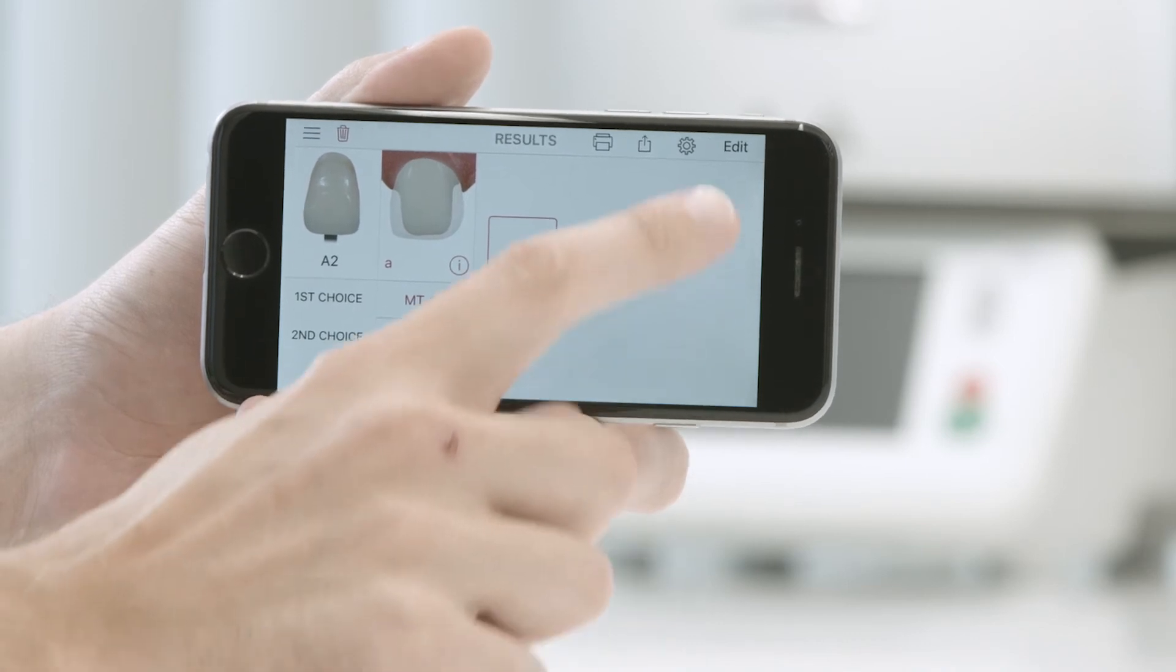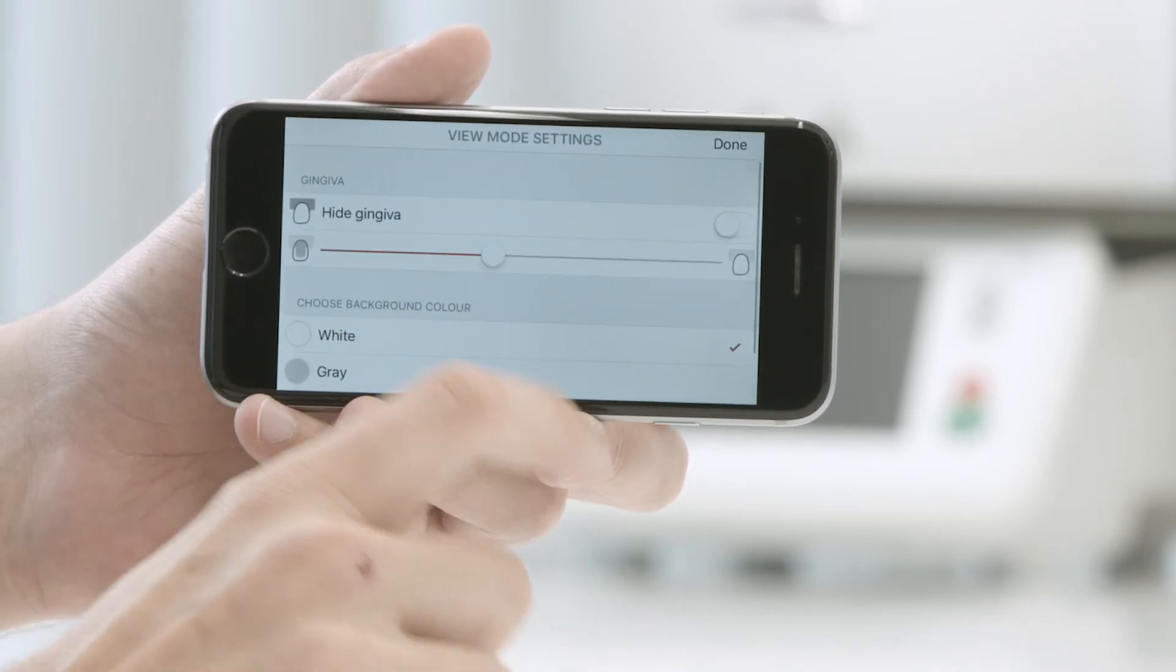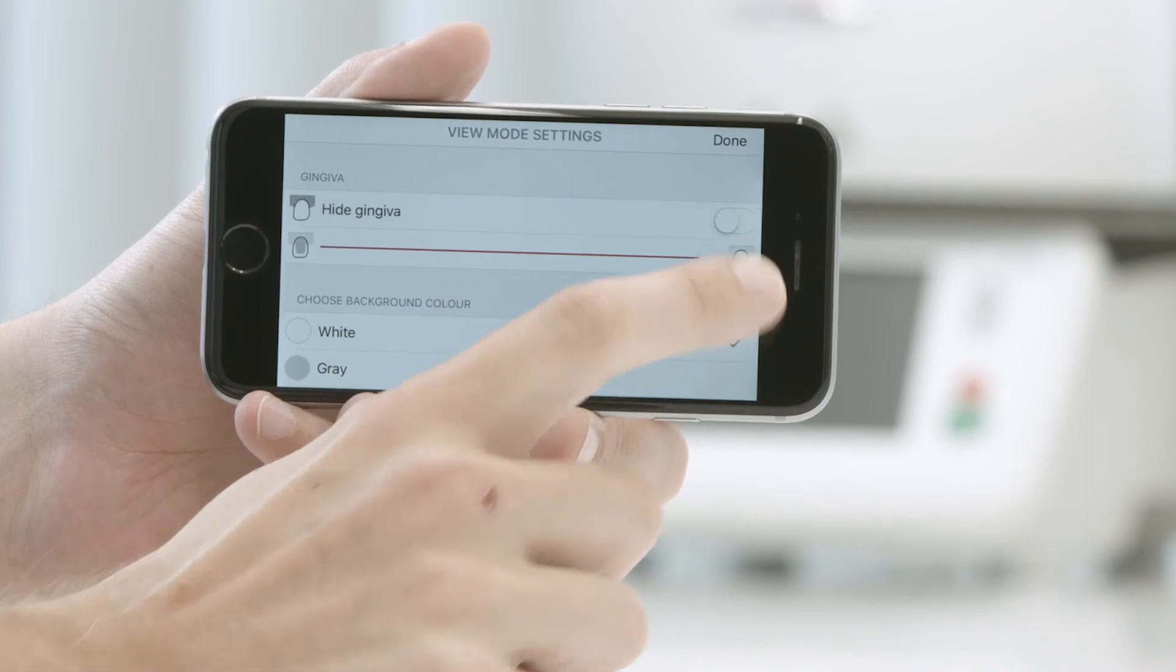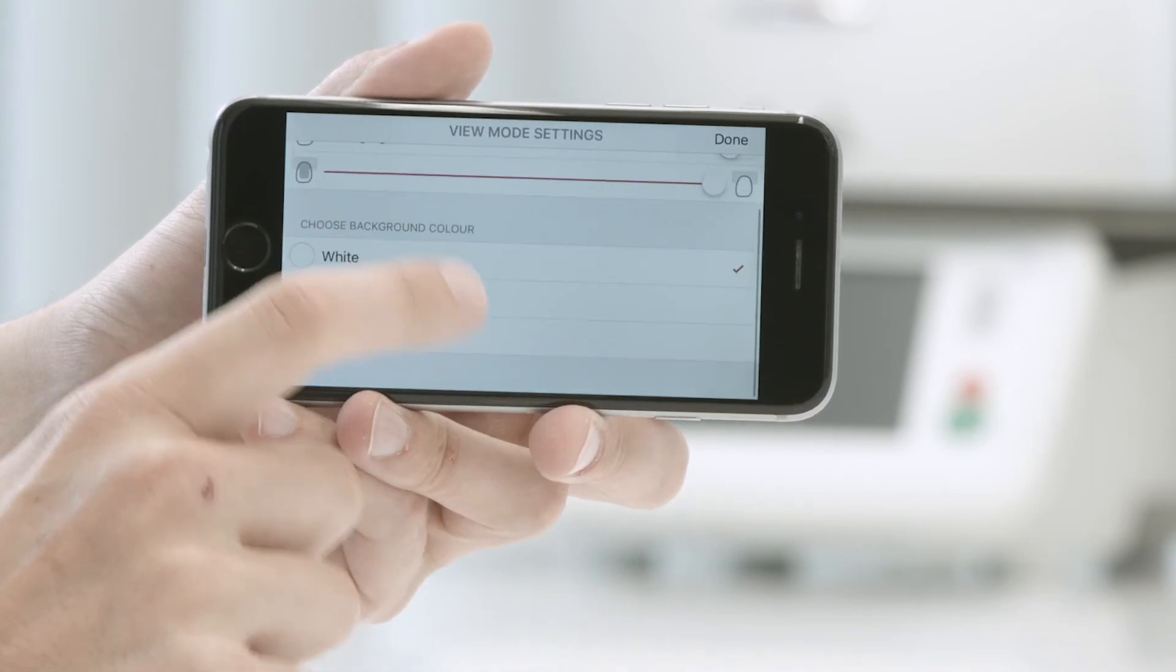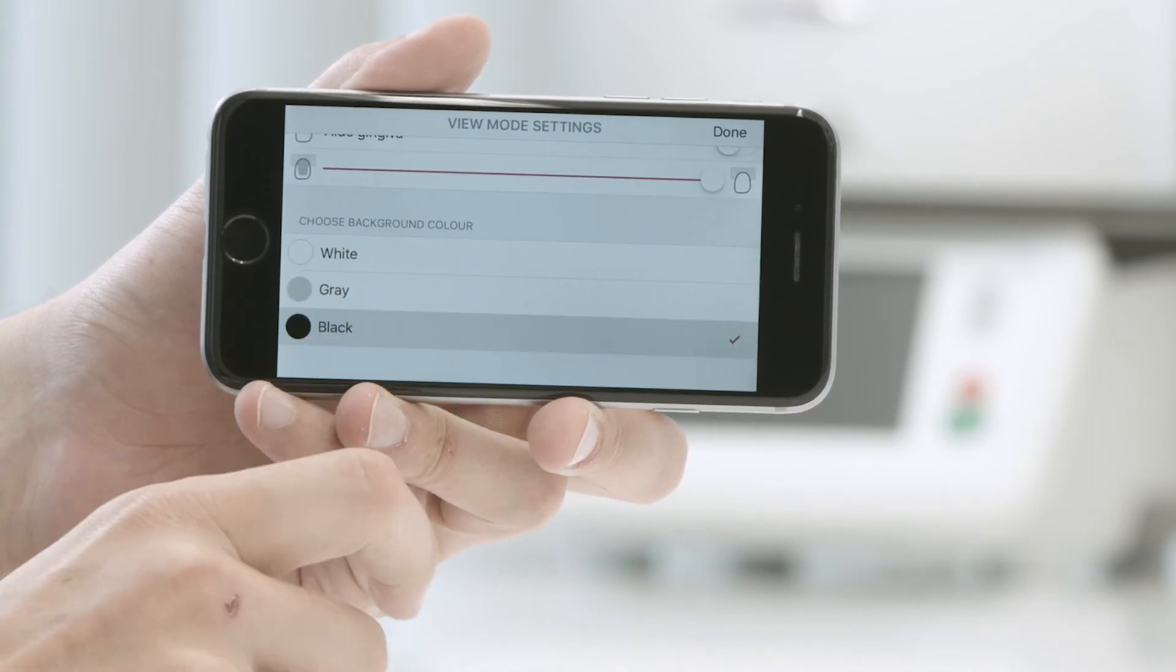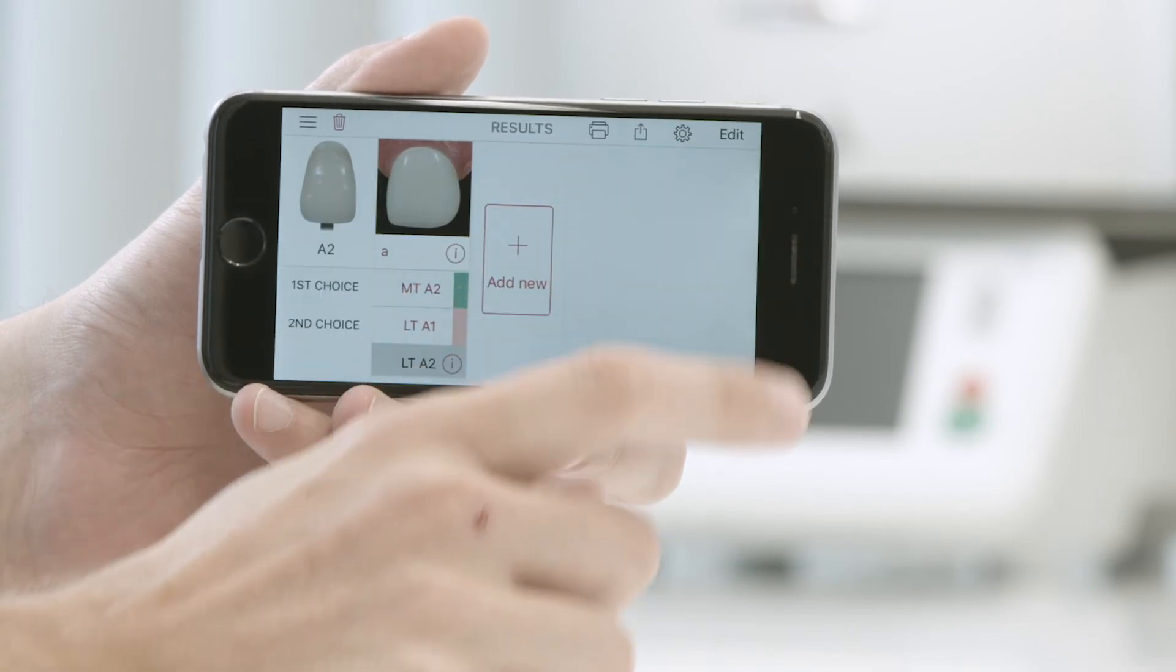You can also change the background color. Go to the color that you want and select it. Bear in mind that the background color has a decisive influence on the way you perceive the shade.